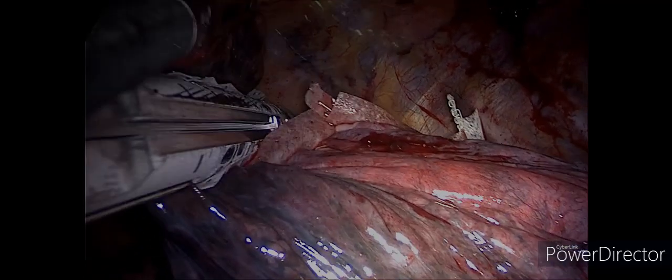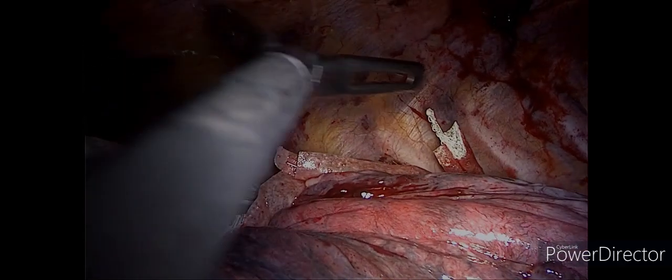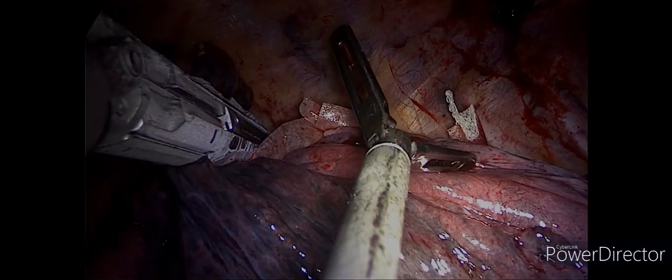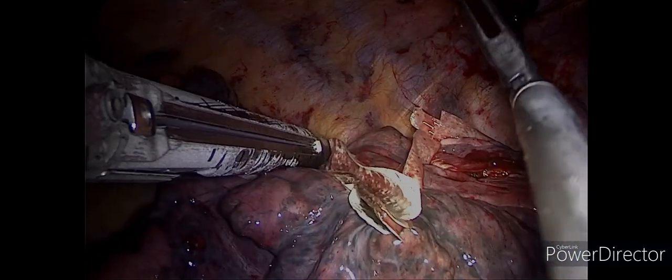These reinforced staplers are very helpful in pneumostasis and hemostasis of tissues, as shown in previous studies.